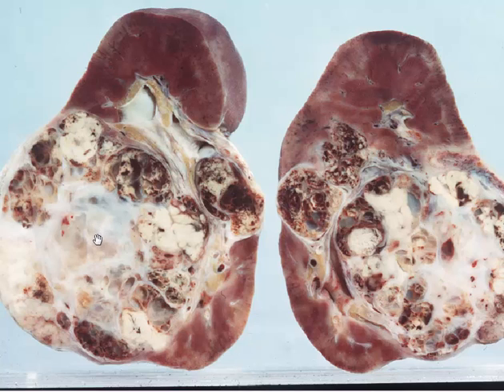These areas represent fibrosis, and you can see that it's central and it has a classic stellate or star-like appearance of central fibrosis seen within a tumour. The next areas you might notice are the dark brown areas, which represent focal areas of hemorrhage within the tumour. This is an indicator that these renal cell carcinomas are highly vascularized tumours.